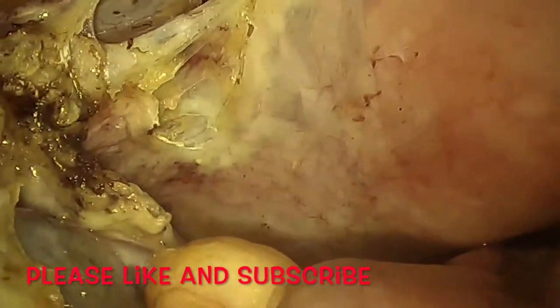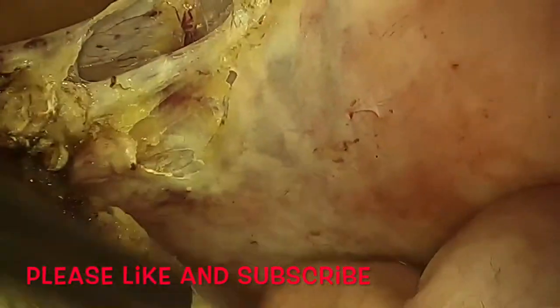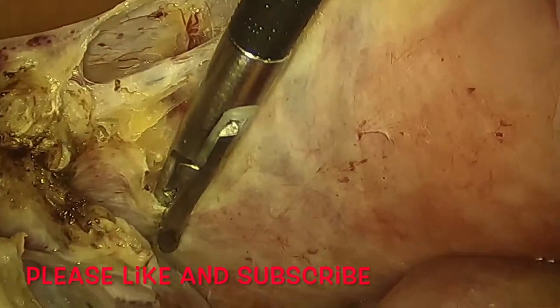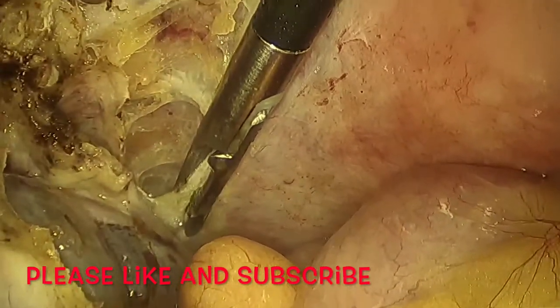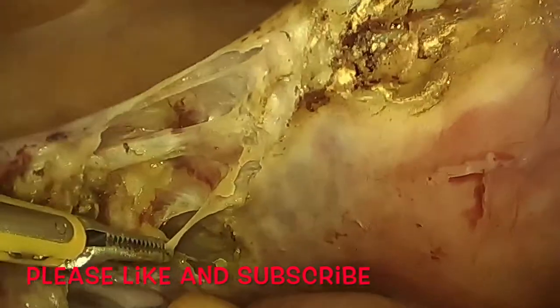Laparoscopic hysterectomy, I believe, has come of age presently, and it has become one of the gold standard techniques to perform hysterectomy worldwide. It has several advantages for the patient as well as the surgeon. For the patient, the laparoscopic hysterectomy gives us minimum trauma to the collateral structures, that is minimum collateral damage, which causes way lesser pain, way lesser bleeding.